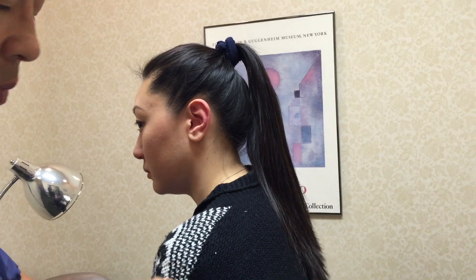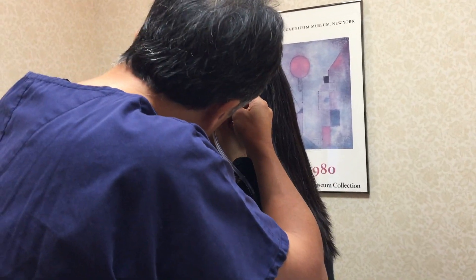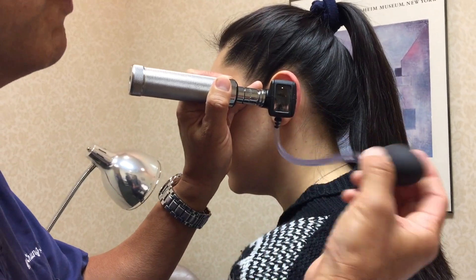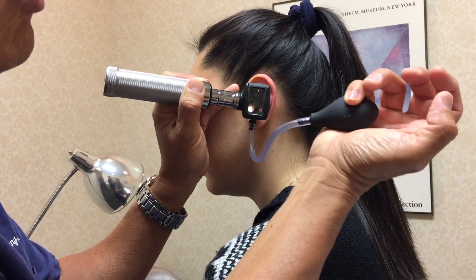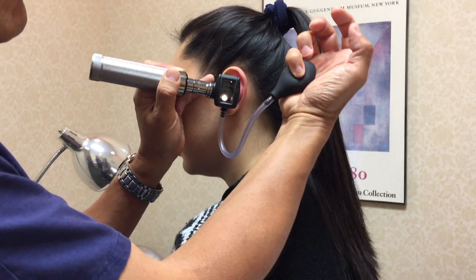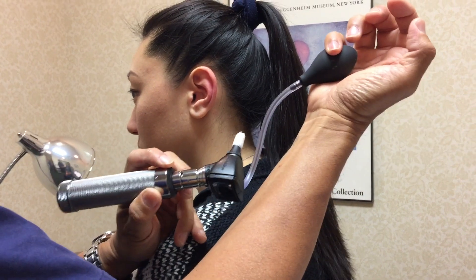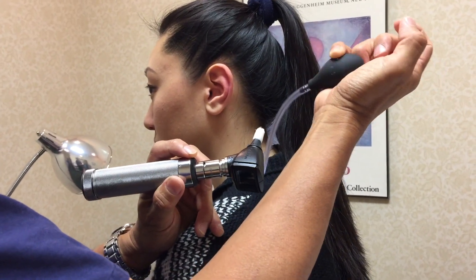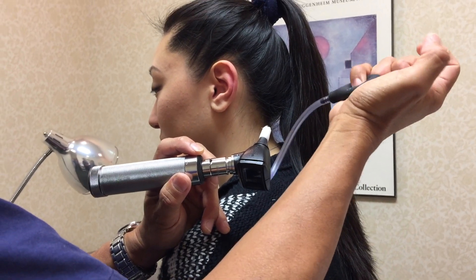I'll turn this on. You place it in, and now I've got a good seal — the patient will tell you it doesn't hurt. You can actually press kind of firmly. Then you hold this in this hand, and when you're visualizing, you just go like this. That's all you need to do. If you have a good seal and you do this aggressively, you will hurt the patient — and maybe I've never blown an eardrum, but you could theoretically damage the eardrum with that kind of action.